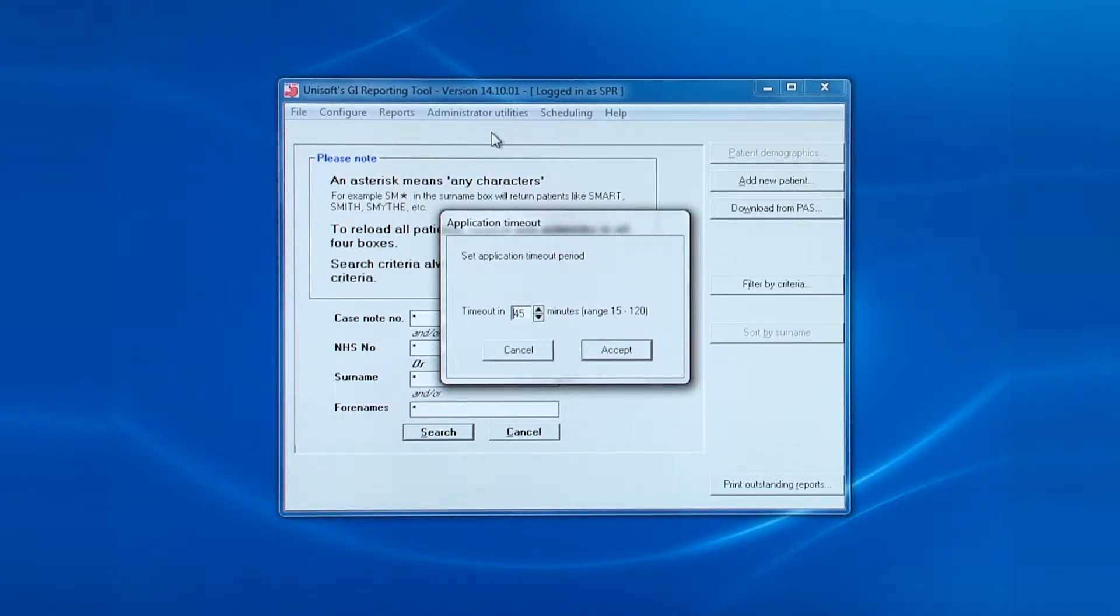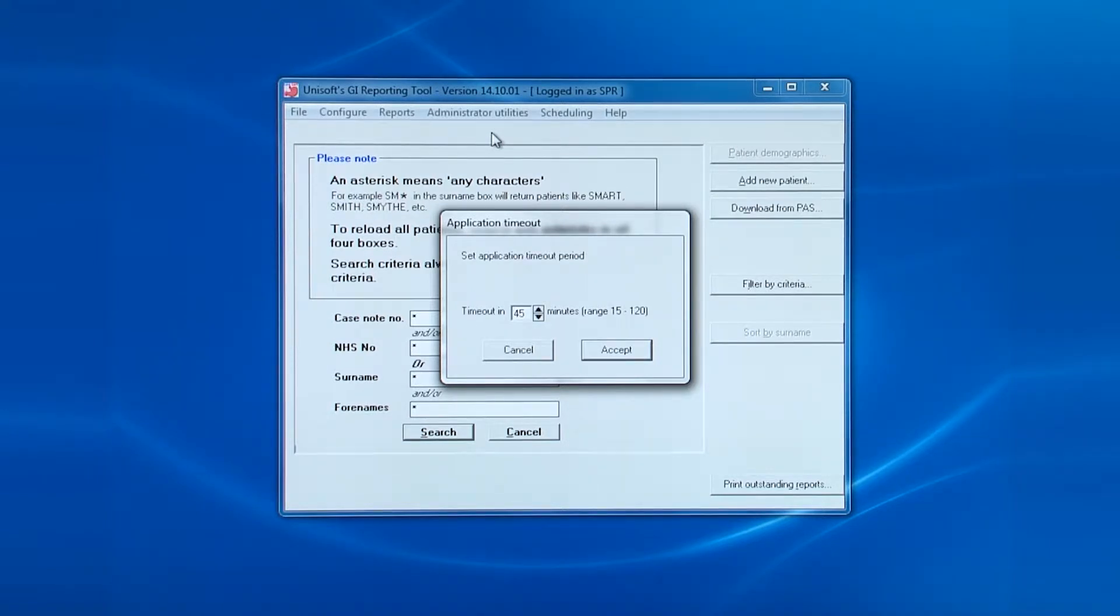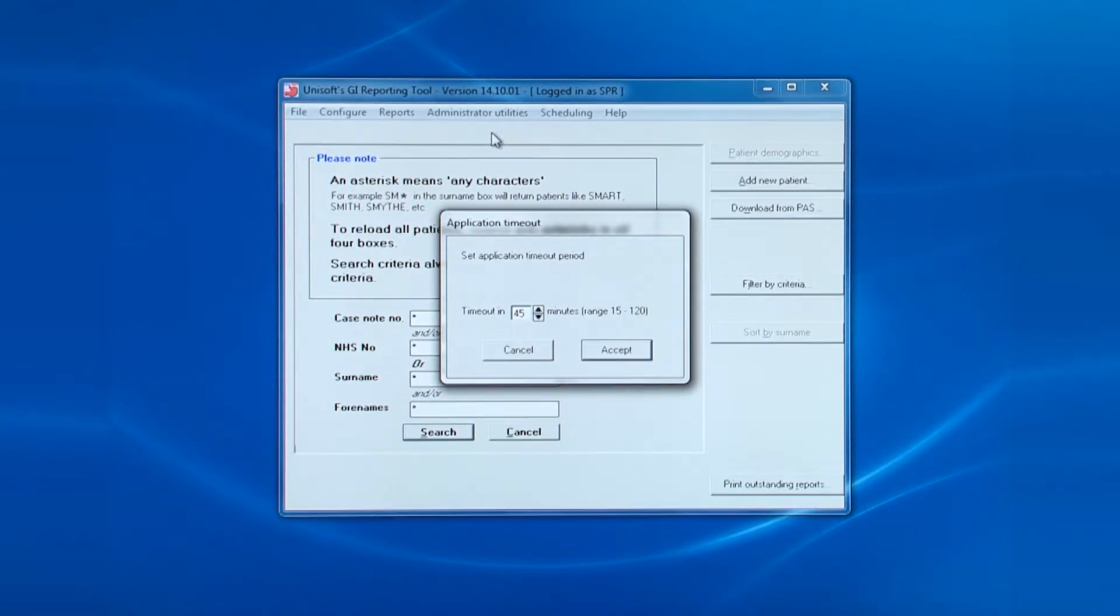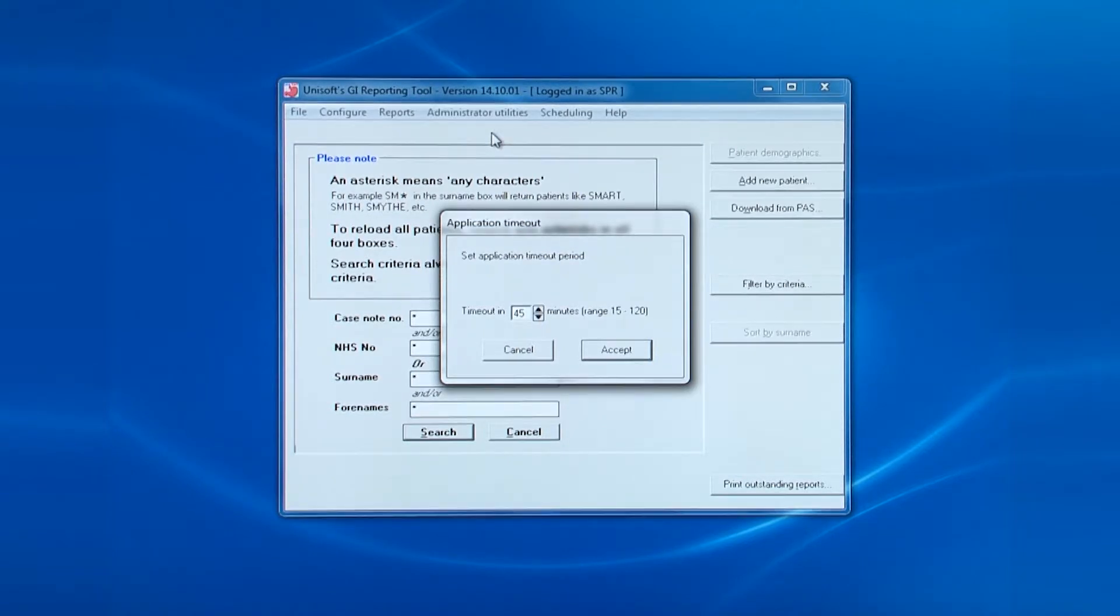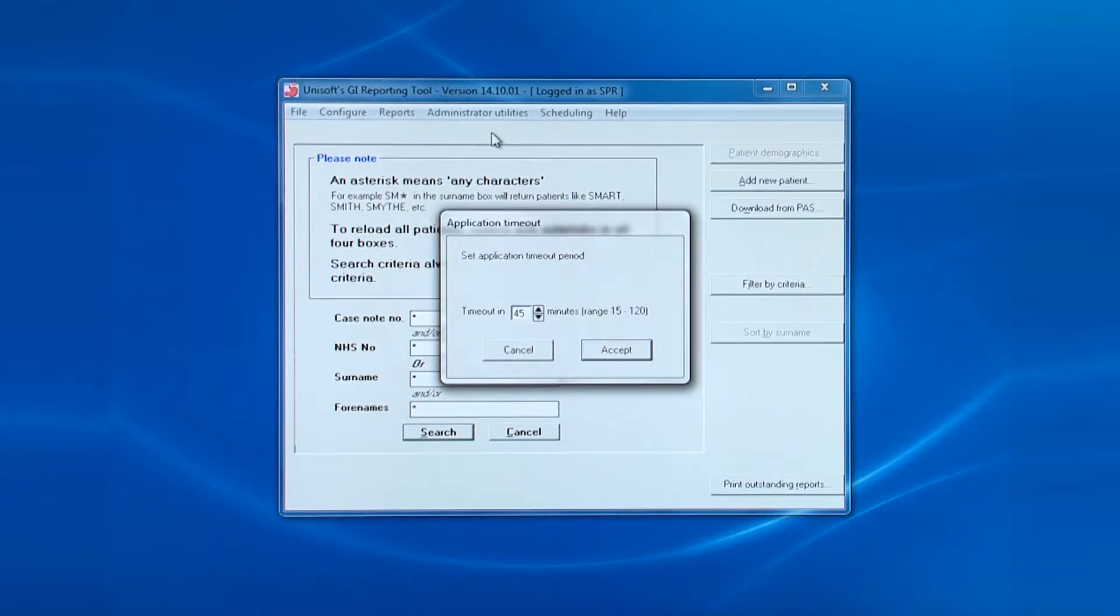This function comes into play, as commonly happens, if the endoscopist has not logged out of the software before going to lunch. The software will automatically log the person out. You can see that the default is 45 minutes.